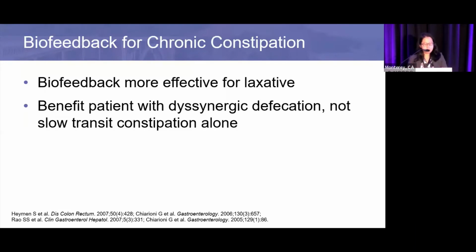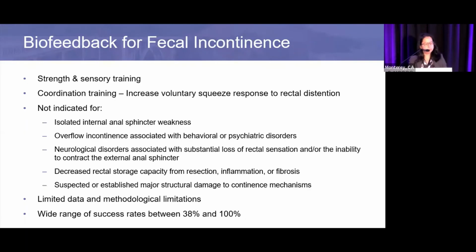Biofeedback for chronic constipation, those with dyssynergic defecation, is actually more effective than laxatives. Going back again, we're talking about the coordination of muscles. If you just give them a laxative, it's not going to help them coordinate those muscles. So it really benefits patients with dyssynergic defecation, not slow transit constipation alone.